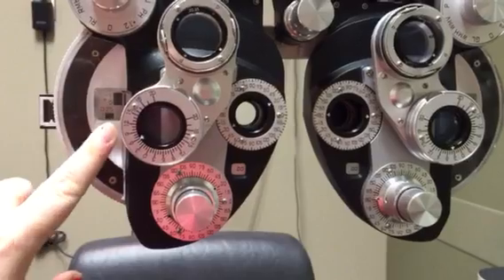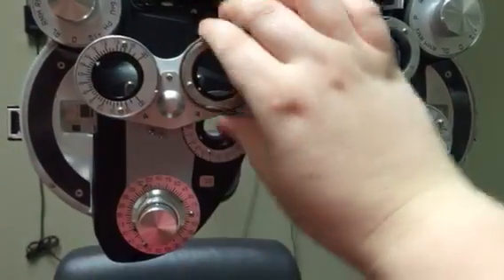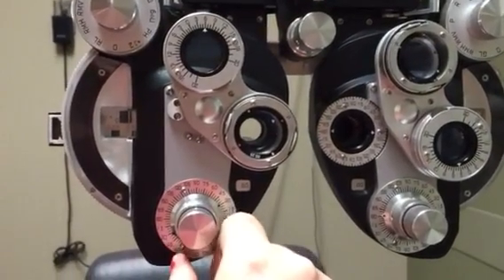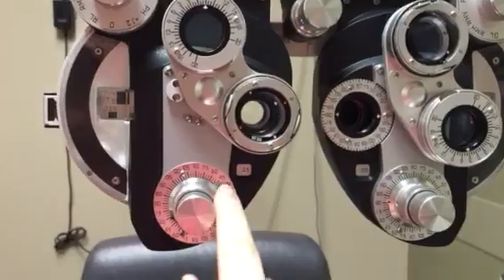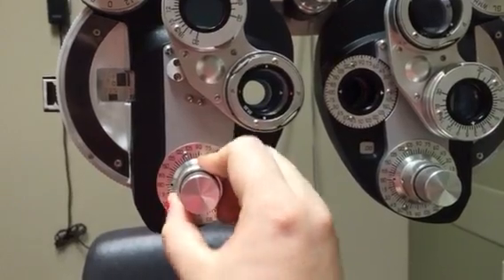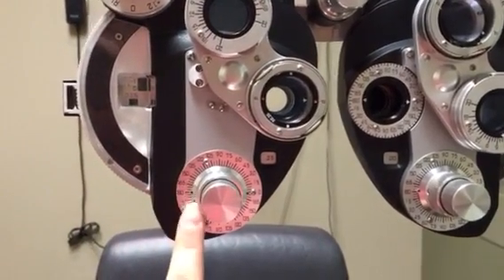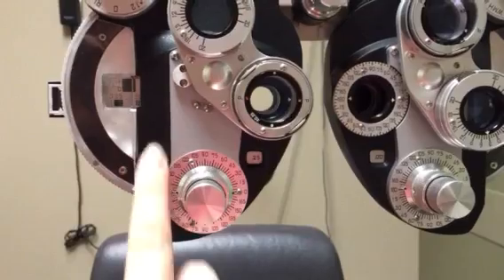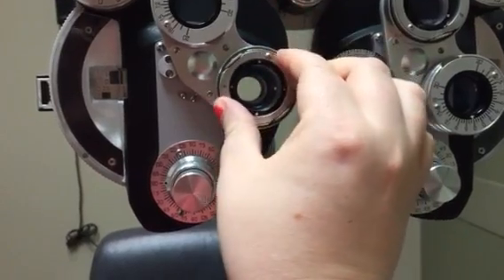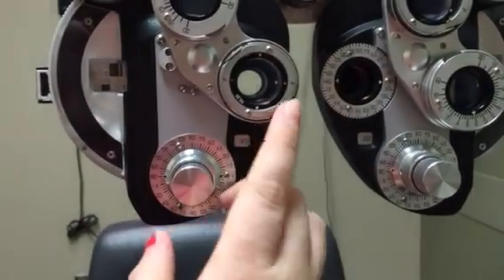Once the sphere is set and everything looks the same to the patient, move on to astigmatism power. Bring the Jackson cross into position. First, check whether they need any astigmatism correction by putting in a quarter of power — turn the knob to add plus one quarter. You can start at 180 to keep a mental note of where you are. Adjust the outer knob so the P lines up with that axis.